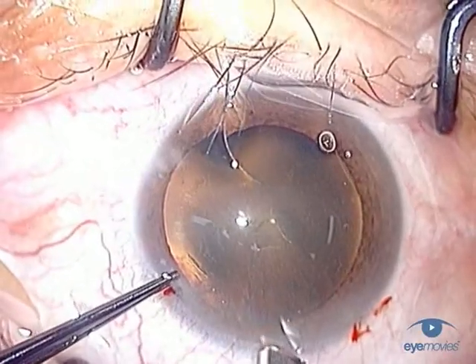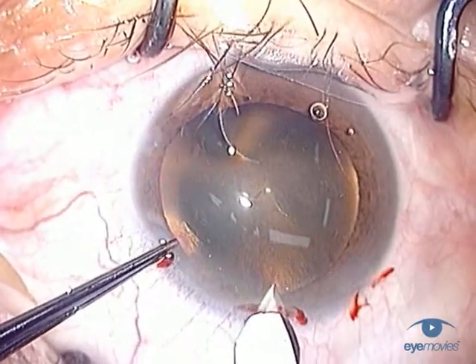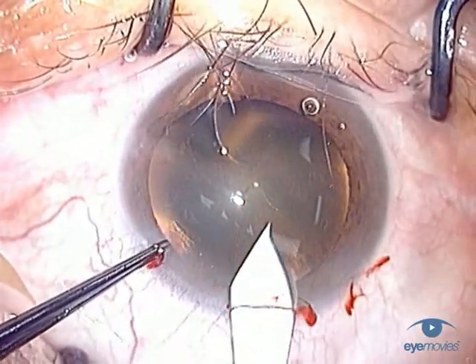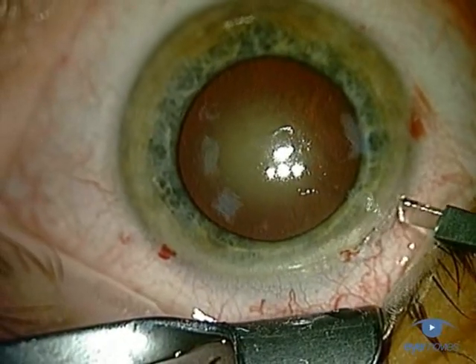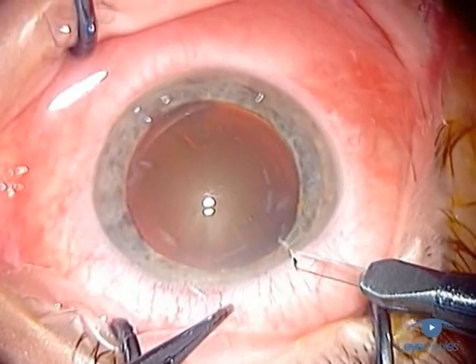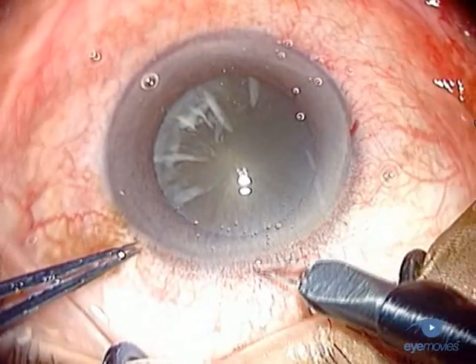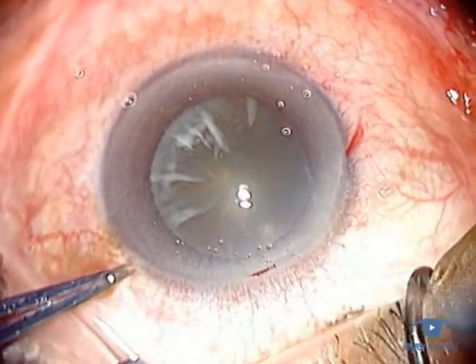However, with experience and judgment, you can achieve a perfectly acceptable result just with freehand use of the keratome or other suitable blade. Aim for about a third of the thickness of the cornea. Just be aware that if you do go too deep, to 500 microns or more, you will induce some astigmatism. However, this can of course be used to your refractive advantage where appropriate.